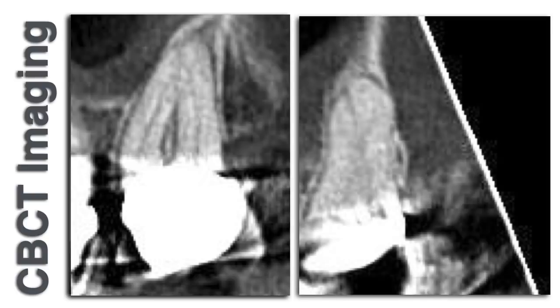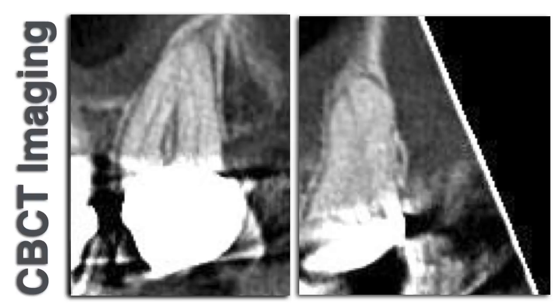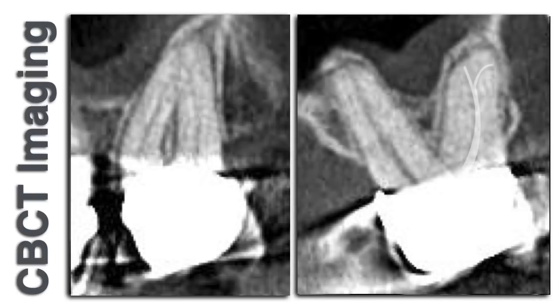Looking at the CT projection of the buccal roots in their non-foreshortened position allows us to look at the mesial buccal root. We see an MB1 and MB2 here — an exact reflection of what we saw in the conventional image, so that's reassuring. Looking at the distal buccal root, it looks like it has an apical bifurcation, and we'll find out postoperatively if that was the case. In this live demo, all the anatomy seen preoperatively was addressed and displayed in the post-op fill.